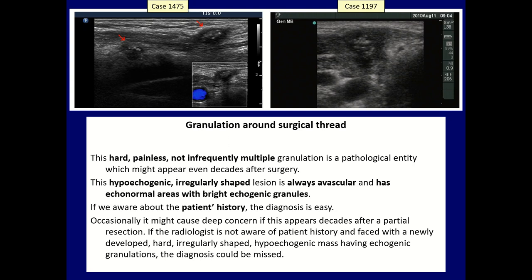The hallmark or the clue is the patient history. It can occur even decades after the surgery, and not infrequently patients forget about this previous surgical intervention. If we are not aware of this history, we can misinterpret such hyperechoic masses as suspicious of thyroid cancer.